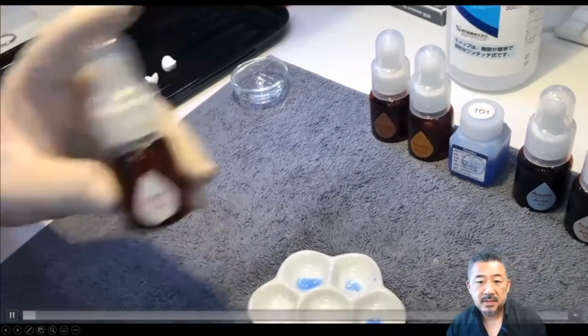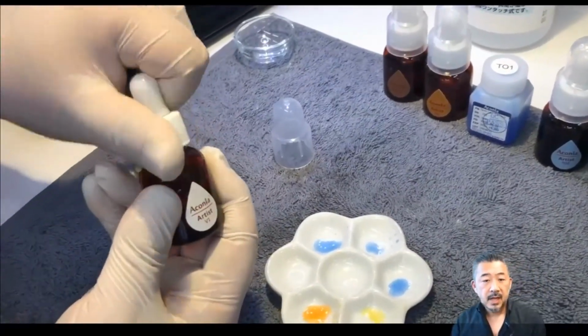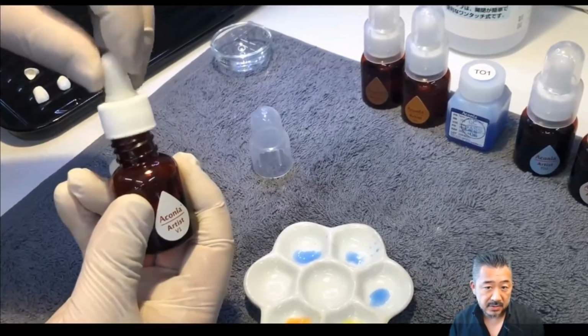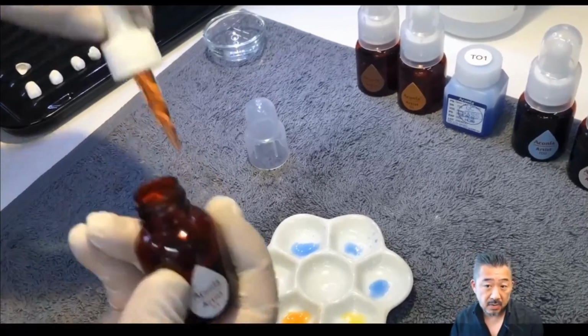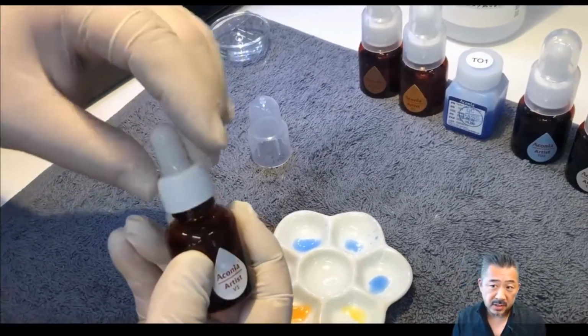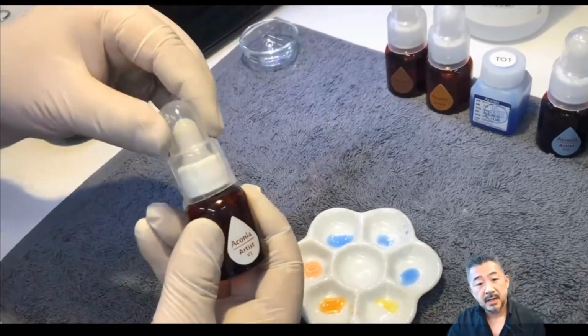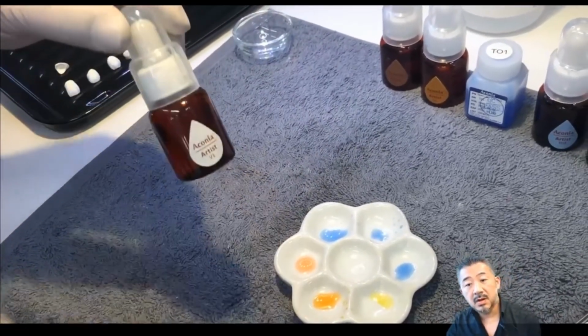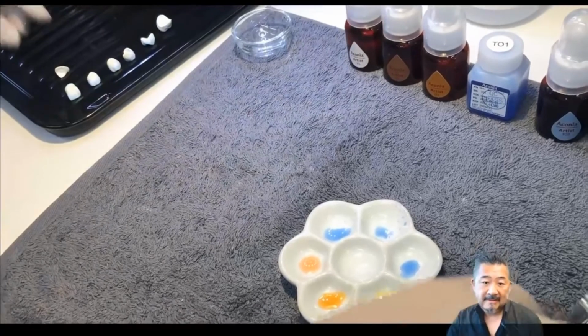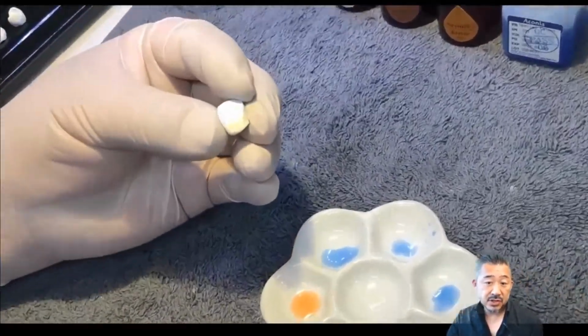As a supplement, there is a stain called V1 Opaque. This is applied to the inner side of the zirconia crown and has the effect of blocking the color inside. So if the core is discolored or contains a metal core, it's effective to shield that color.